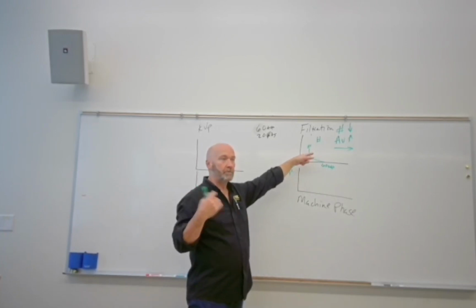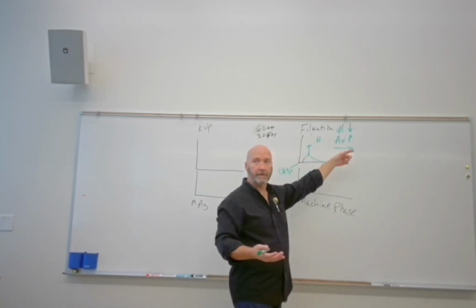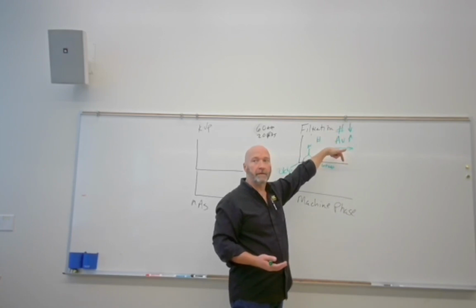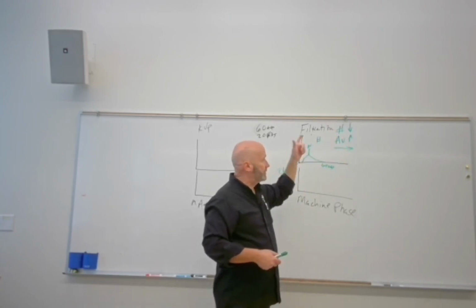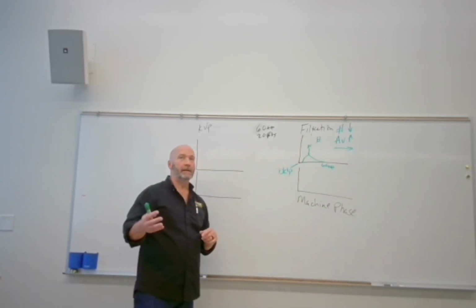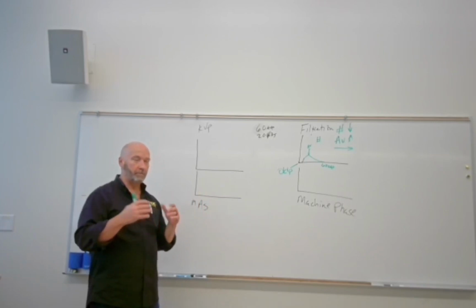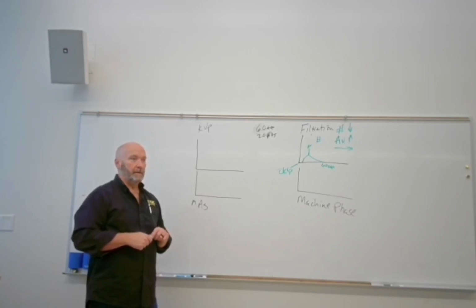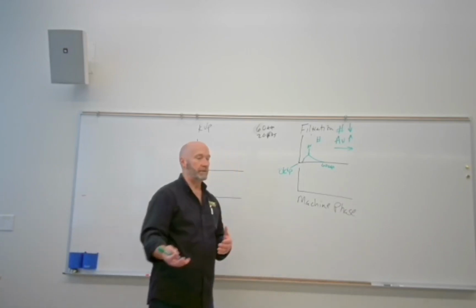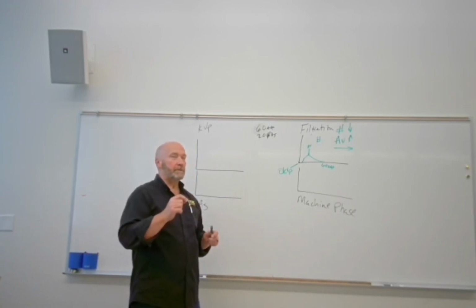If you increase filtration, because of tube aging you get an increase in inherent filtration, your numbers continue to go down, your average continues to go up, and it continues to push towards the high energy side. You get to a beam that's more homogeneous. All energy levels are more similar. So you get to a point where the tissues that you penetrate are penetrated at more of the same rate.